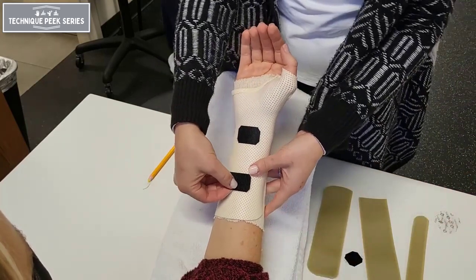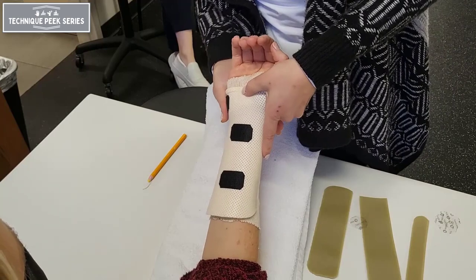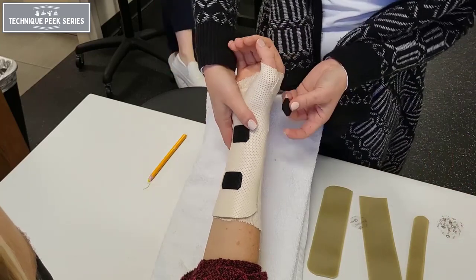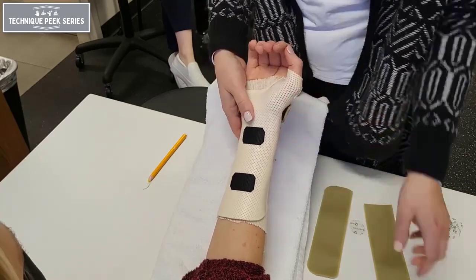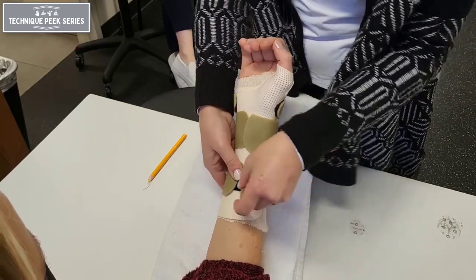Thanks for tuning in to this instructional video on how to fabricate a forearm-based thumb spica splint. The material shown is a lightweight material helpful for diagnoses such as repetitive strain injuries or severe CMC joint arthritis. For postoperative or post-fracture cases, you would want to use a thicker material that provides more stability and immobilization.